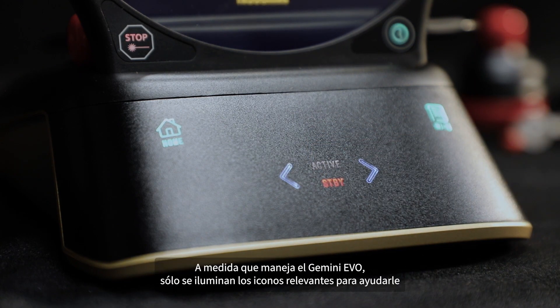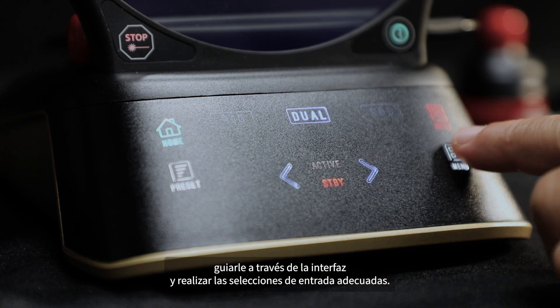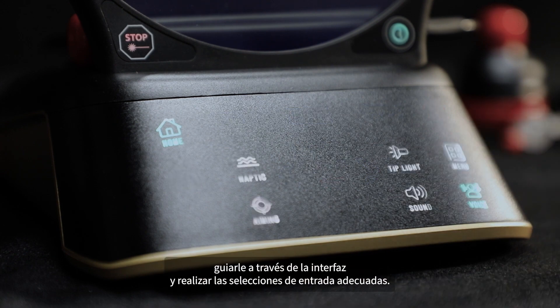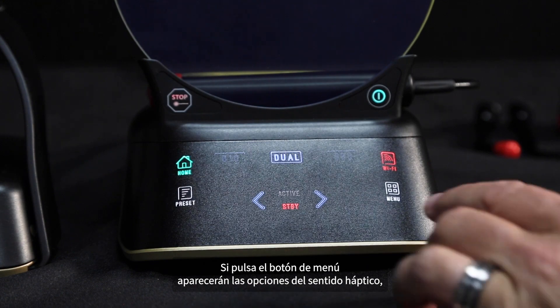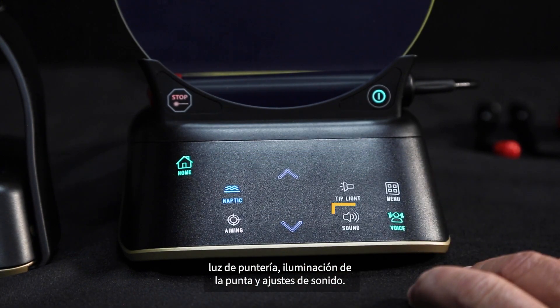As you operate, the Gemini Evo only relevant icons light up to help guide you through the interface and make proper input selections. Pressing the menu button brings up the options for haptic sense, aiming light, tip illumination, and sound settings.